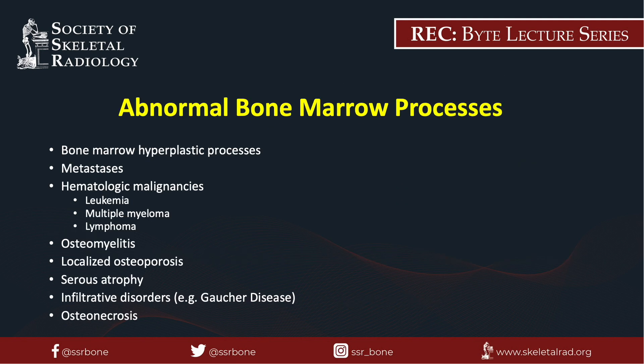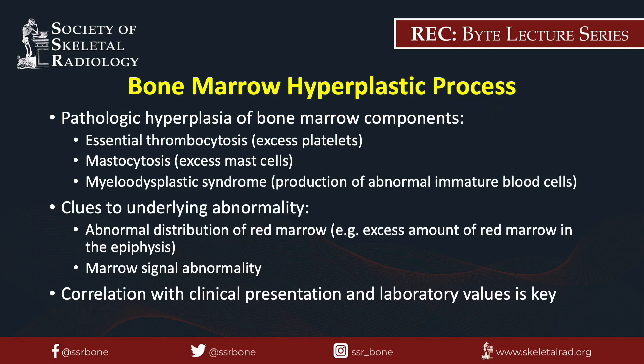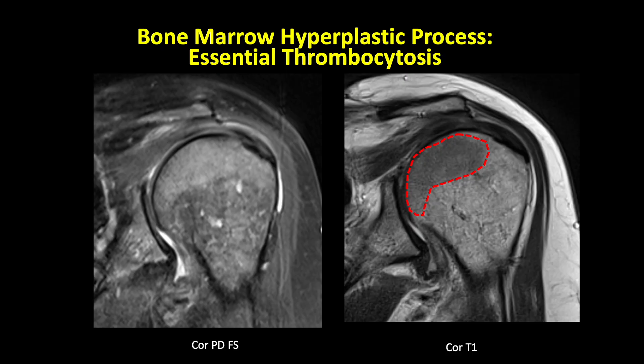Bone marrow hyperplastic processes represent conditions of pathologic hyperplasia of bone marrow elements and include conditions such as essential thrombocytosis, mastocytosis, and myelodysplastic syndromes. Clues include abnormal distribution of red marrow as well as abnormal marrow signal; correlation with clinical presentation and laboratory values is key. Here's an MRI of a shoulder in a patient with essential thrombocytosis — within the epiphysis there is a disproportionate amount of red marrow relative to the metaphysis, which is not consistent with red marrow reconversion and is compatible with their known history of essential thrombocytosis.